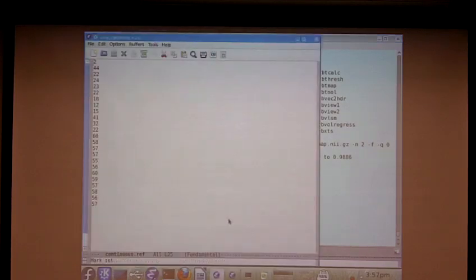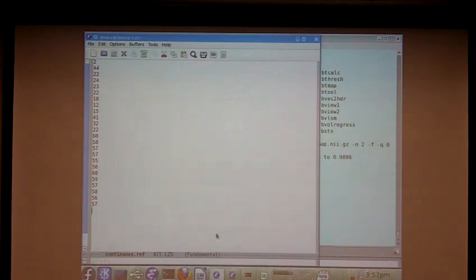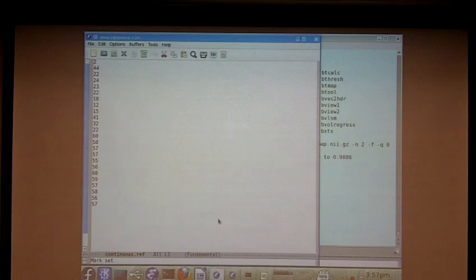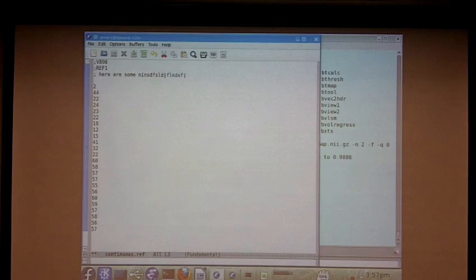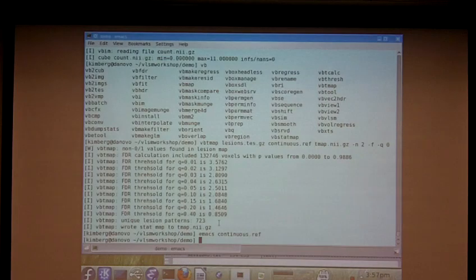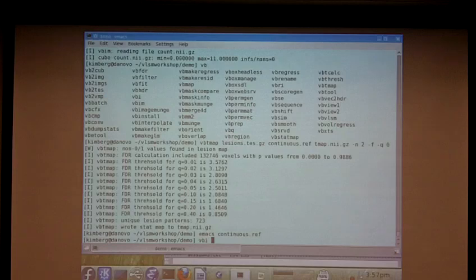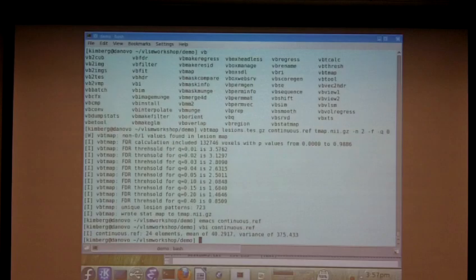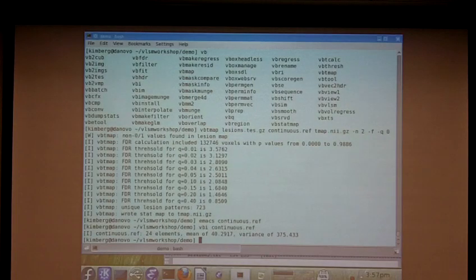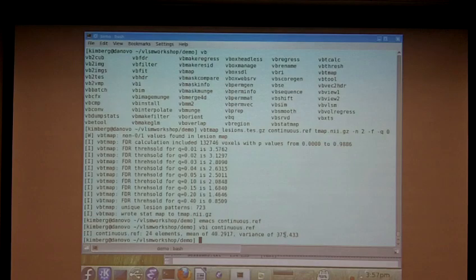So let's just look at that continuous file. So the format should be obvious. It's one number on every line. Some Voxbo files actually have some extra garbage up front where they say VB 98 ref1, here are some interesting blah, blah, blah. And that won't change how it's parsed. But it's very helpful to use a VBI command if you're not sure if a file's being parsed correctly. So we can do VBI continuous.ref, and you can see that despite all that garbage I just typed, it still knows that it has 24 elements with a mean of this and a variance of this. So they're just text files.